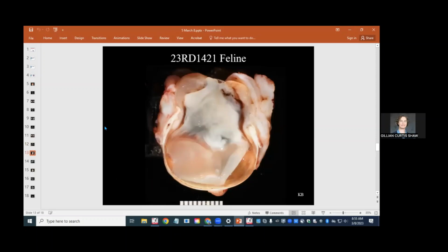So, eye from one side, eyelid mass from the other side. Remember that. The only history they gave us was corneal perforation in the right eye and a pigmented mass of the left lower eyelid. They also told us that it had herpes virus, hypertension, chronic kidney disease in a 14-year-old cat, and IBD.